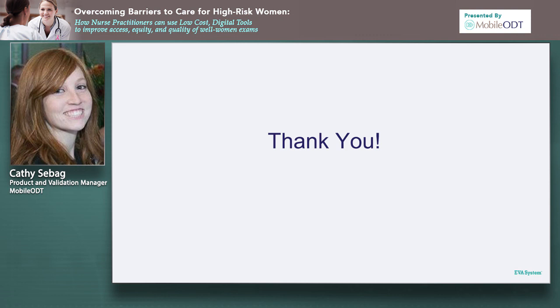Again, it's those 4 simple steps: getting trained, getting the lab tests you need, that Pap Smear and HPV test, investing in simple digital tools. One example is the Eva system that we think is easy and portable. There's also many other different types of colposcopes out there you can use to provide that secondary screening. And the 4th is making sure you have those connections with experts to help you better serve patients in your office. We really want to reiterate, it's easier than you think.